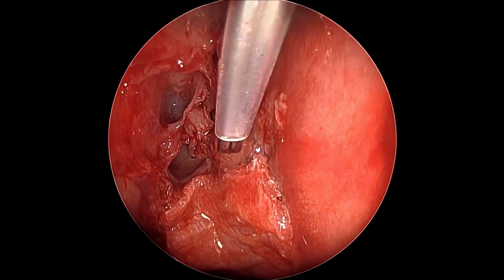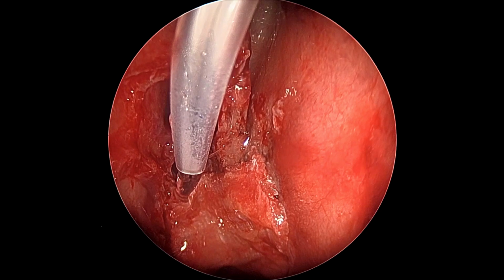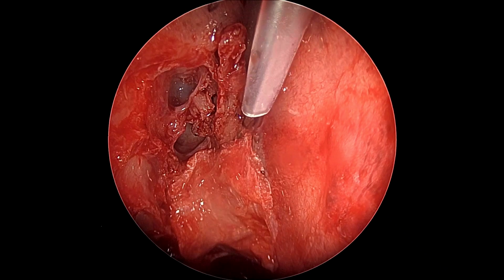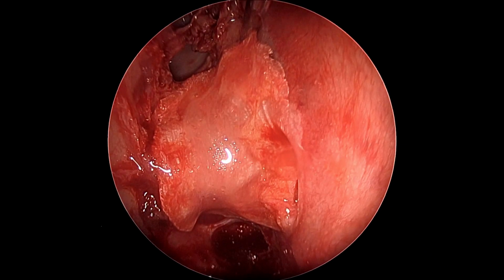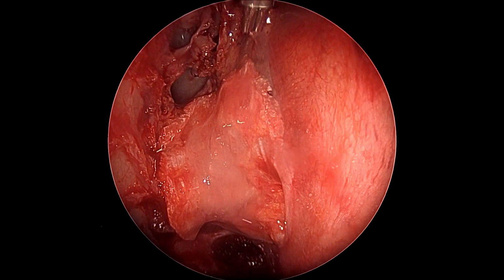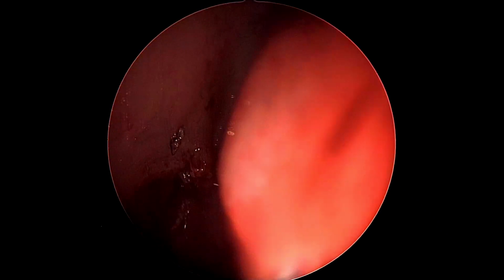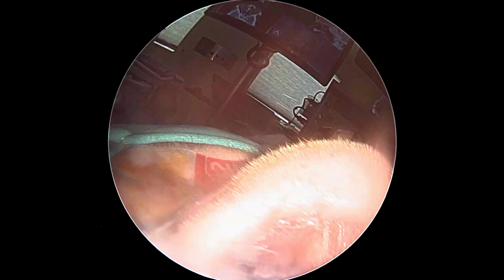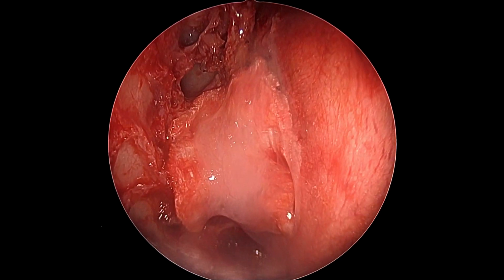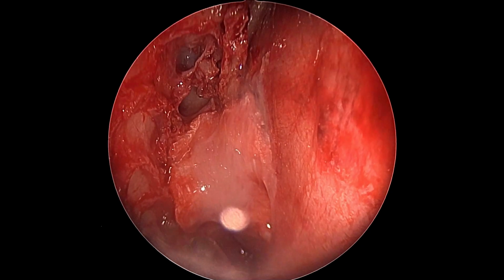And now we just add a layer of tissue glue to cover this. We normally do not recommend the use of tissue glue in between the fat and the fascia, because the fascia needs to come in contact with the fat, needs to come in contact with the bare bone for proper healing and taking up. So we use the glue only at the end of our repair, however many layers there would be. Even if there was a vascular flap, then you would have only used the glue over the vascular flap in the end, and only once, and not in between the layers, because then that creates space and sometimes can lead to graft failures.